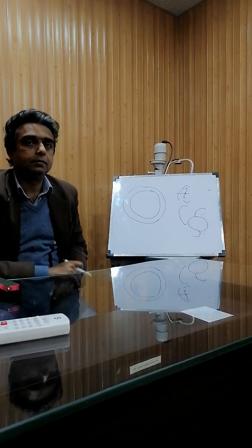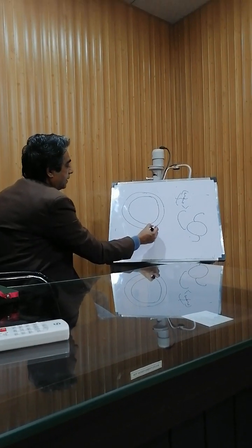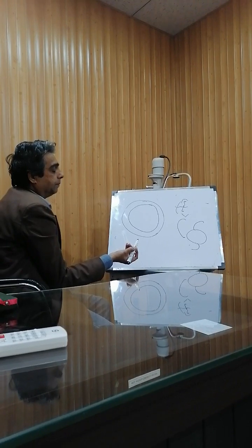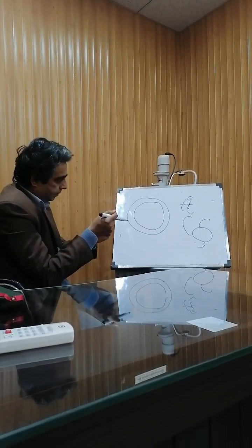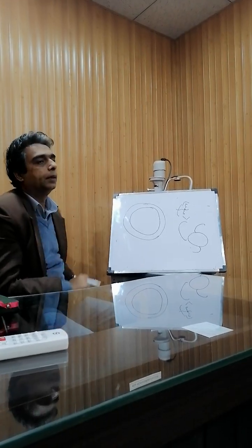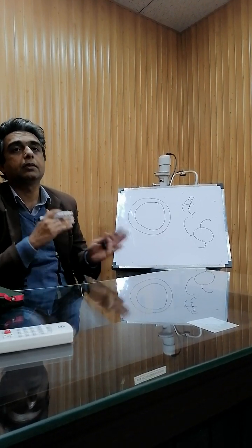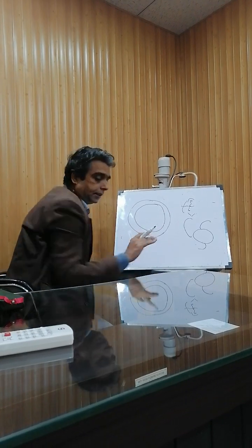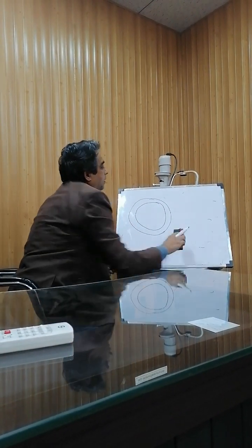I need your attention. Okay. After giving the incision, with a special insulin needle, we curve it and make a knife, and we will not do can-opener capsulotomy. We will do CCC, continuous curvilinear capsulorhexis.